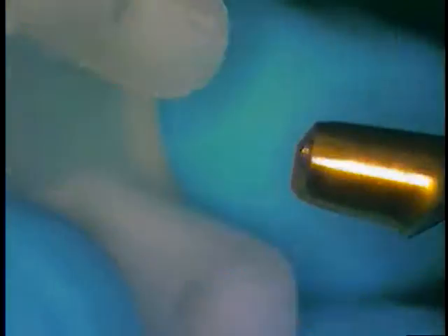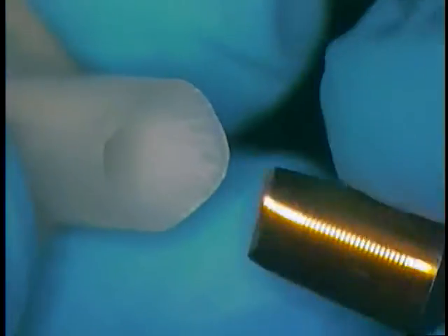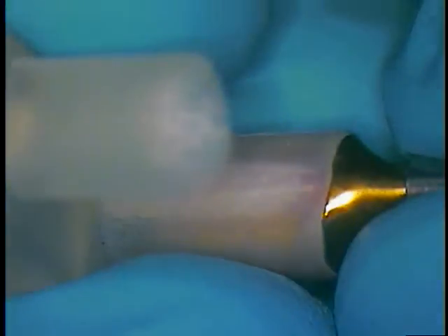Here's the anterior abutment — we just push that down all the way in place, and then we have the other one that coincides with that. Again, I had to try this one in here, but that should go right into place, just like that, without any disturbance.